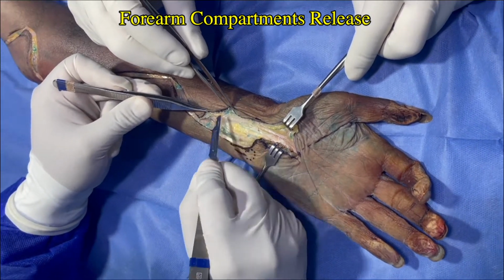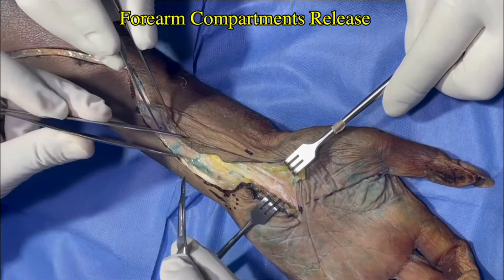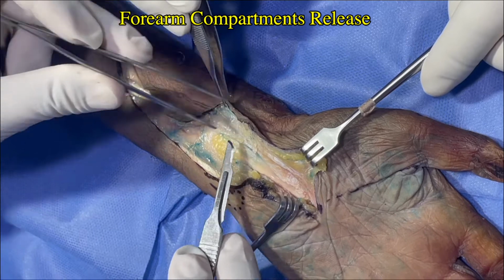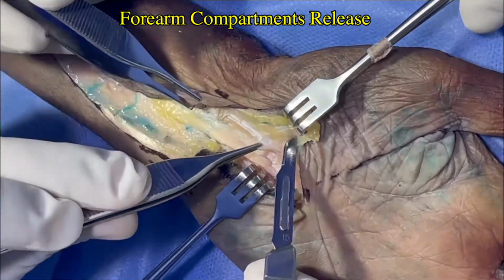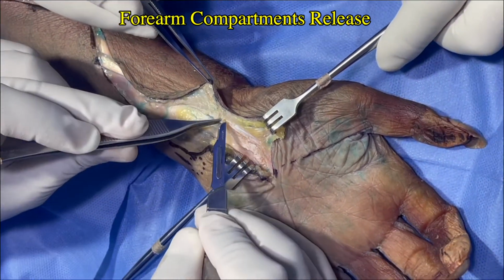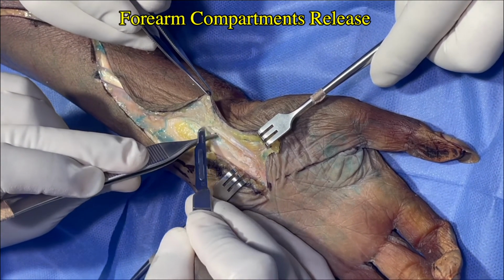When starting with the release of the forearm, the dissection of the radial skin flaps must be careful while respecting the perforating vessels that are directed towards it. Dissecting delicately over the epitendon of the palmaris longus, it is necessary to ligate some communicating vessels between the radial and ulnar system.